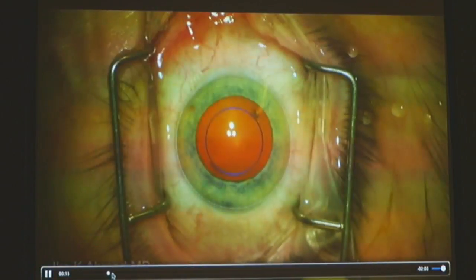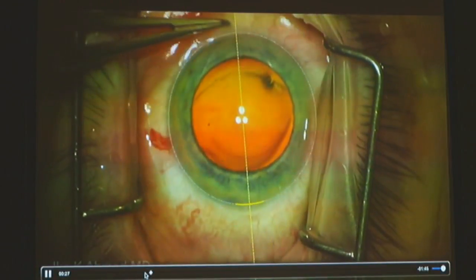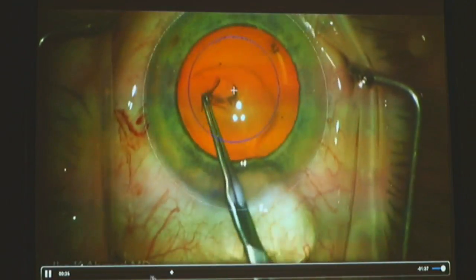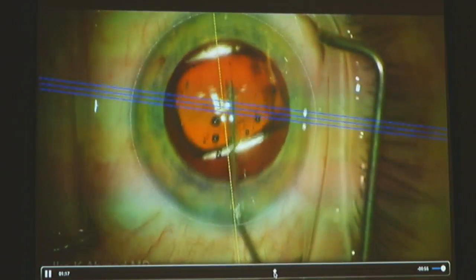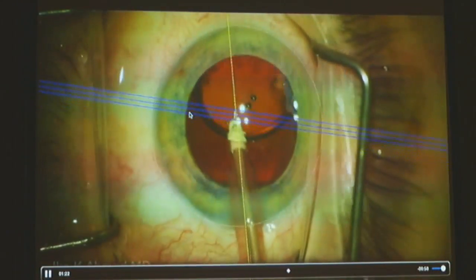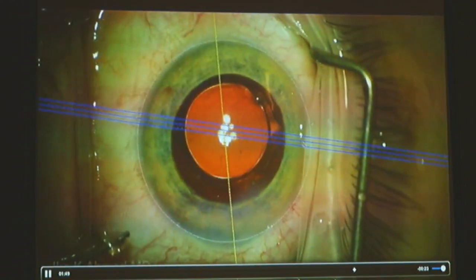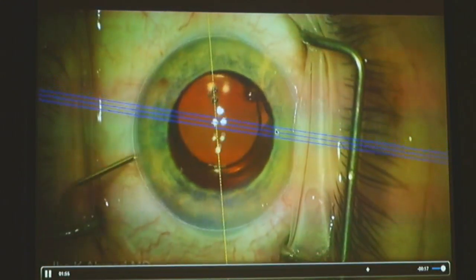For example, take this case where I have the incision at 180 degrees, and even though the eye may be moving, even though there's rotation, cyclotorsion, movement, the microscope and the technology is moving with this and aligning it accurately. We can set a 5.5 millimeter rhexis if we wish, and proceed with the phaco. There's a lens going in, and now you see the toric alignment tool here being used to line up the lens. Of course, we go underneath the toric lens to remove viscoelastic to avoid rotation, and we can line it up nicely, using this advanced imaging system to help identify the marks.